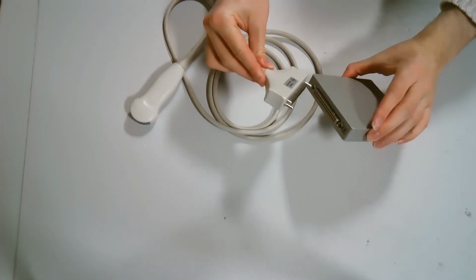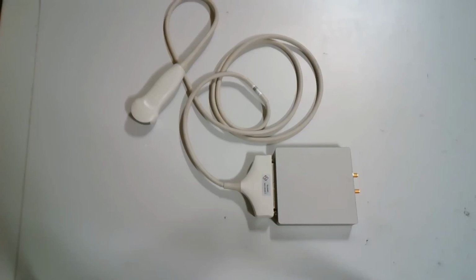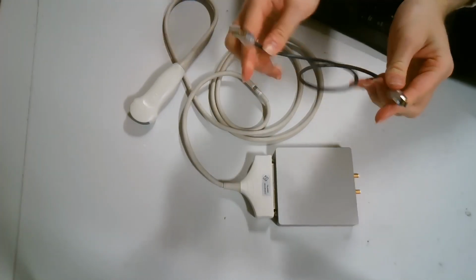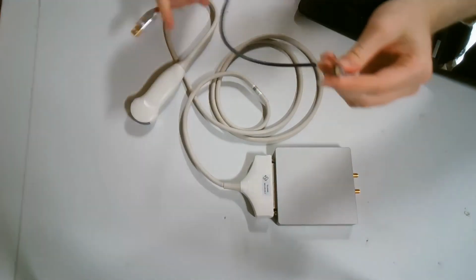Connect your ultrasound probe to the ultrasound scanner. Use the USB-A to mini USB cable to connect the ultrasound scanner to your computer.